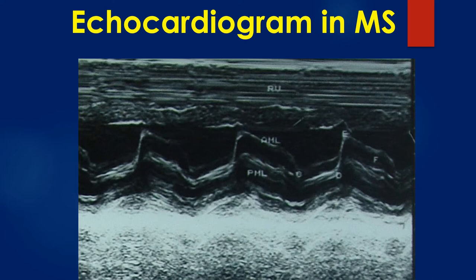M-mode echocardiogram showing the paradoxical anterior motion of the posterior mitral leaflet in diastole with reduced separation of the leaflets. The anterior mitral leaflet has certain points marked in its movement — C, D, E, and F. The E-F slope is reduced in mitral stenosis and becomes almost flat in severe mitral stenosis.